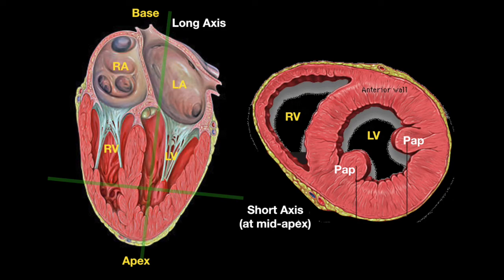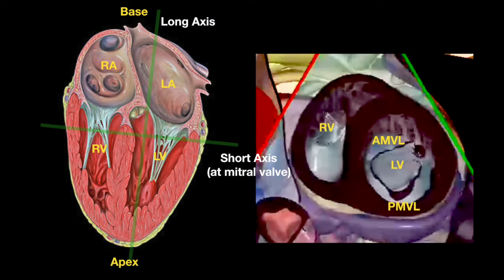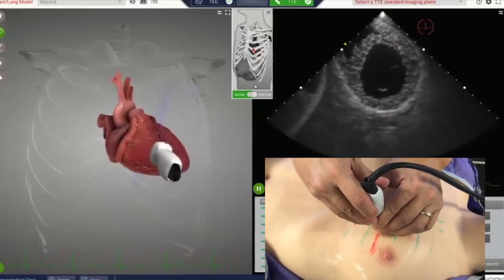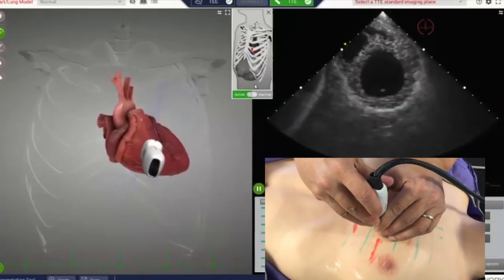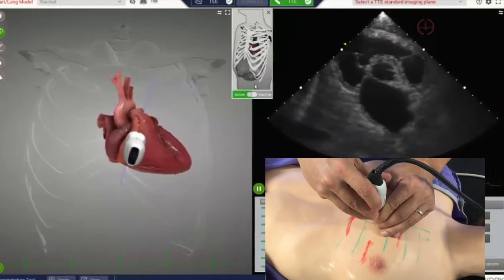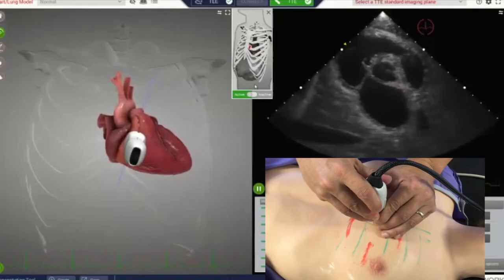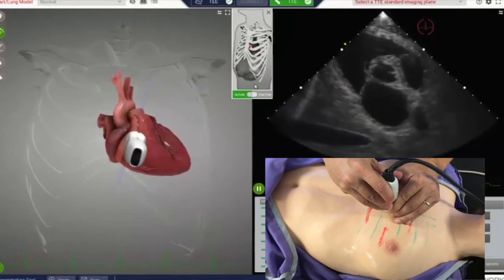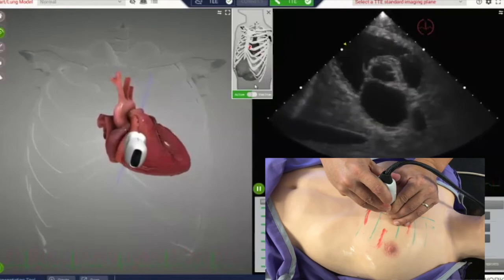We've covered the parasternal level at the mid-apex where you see the papillary muscles. Now slide the probe slowly towards the base using the long axis as a guide. At the level of the mitral valve, you'll see the anterior and posterior mitral valve leaflets. Continue sliding towards the base and you'll start to image the aortic valve with its three cusps in the center. This is the highest parasternal plane — here you're imaging the start of the aorta and pulmonary artery along with the atria. From bottom going clockwise: left atrium, right atrium, tricuspid valve at about 9 o'clock, right ventricular outflow tract on top, pulmonic valve around 3 o'clock, and the main pulmonary artery on the right. This is a very busy but valuable scan plane, especially for advanced assessments of the right heart.